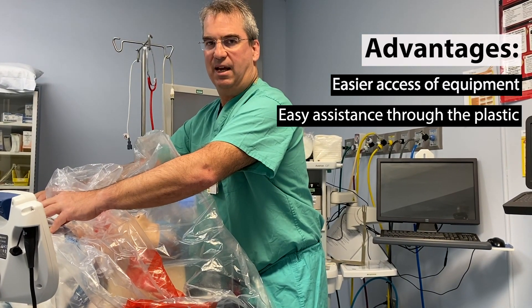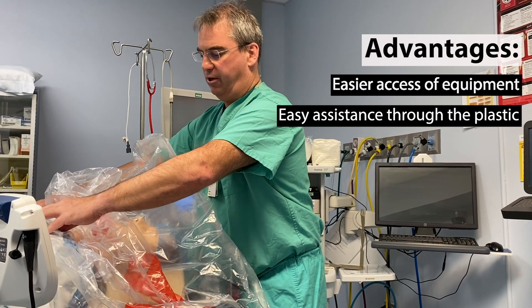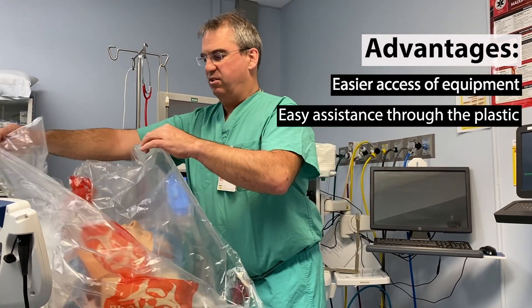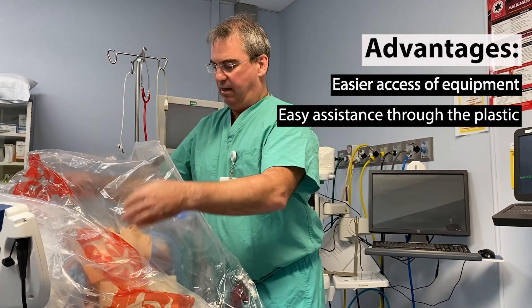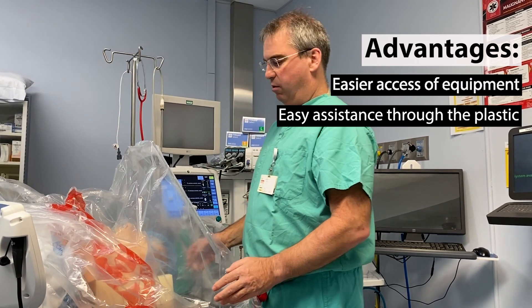They don't have to touch any of the contaminated patient's skin or the contaminated cloth underneath. So they can listen to breath sounds and have everything clean. In the process, they can also help maintain the tent if need be. If it's not maintained well, they keep it tucked around the arms — that would be an assistant.